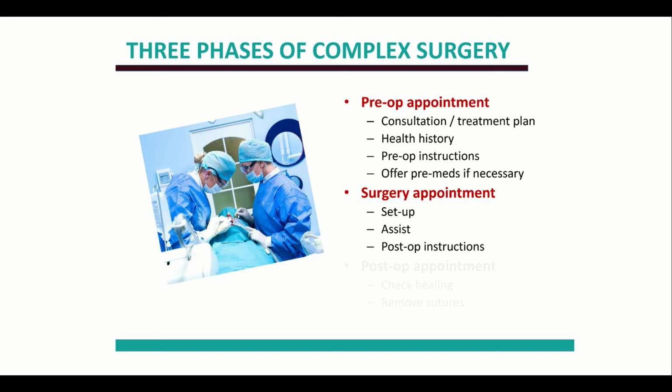Then there's the surgery appointment itself. So again, what are you going to do? You're going to set up the room, get it ready to go. You're going to seat your patient. Again, we would review their health history. Even if it was just the day before, you want to ask them, has anything changed since the last time we saw you? And make sure you know that. And certainly prepare the room, get everything ready to go for the surgery.